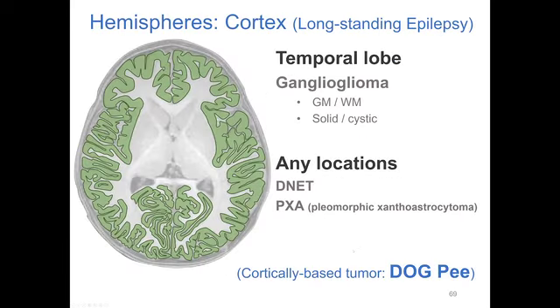Okay, let's move on to cortical tumor, the peripheral gray matter tumor. And usually the cases that will come up for study in this group are for epilepsy, because cortical tumors might present with seizure early in the course, and so you need to remember what's the most common type in this group of patients. It depends on the location. If you see a cortical tumor in the temporal lobe and the patient presents with chronic seizures, this is the top differential diagnosis you should think about.